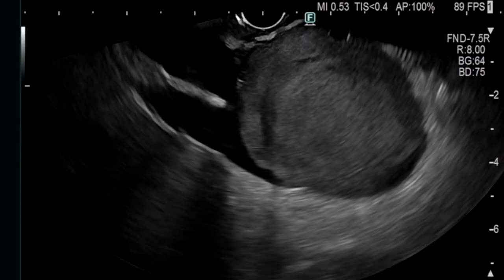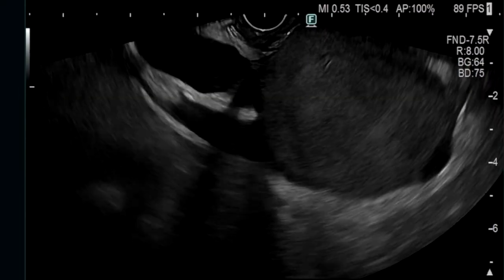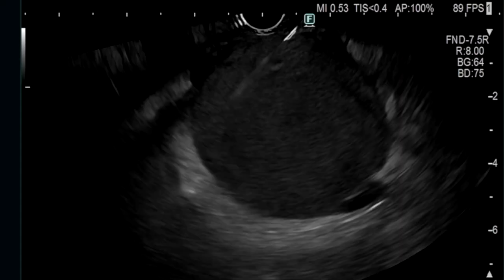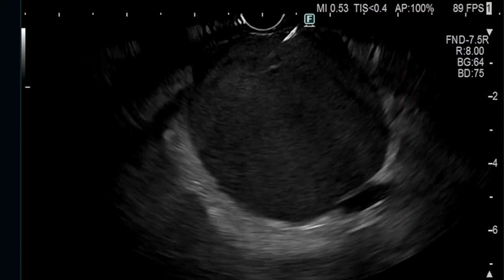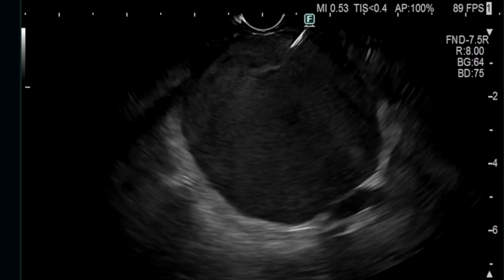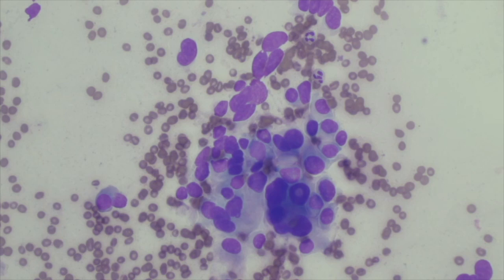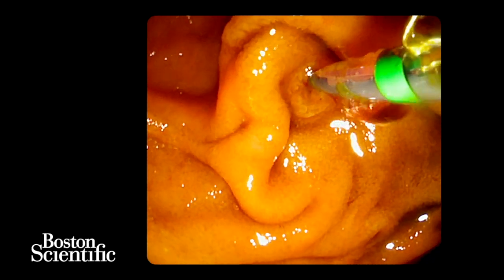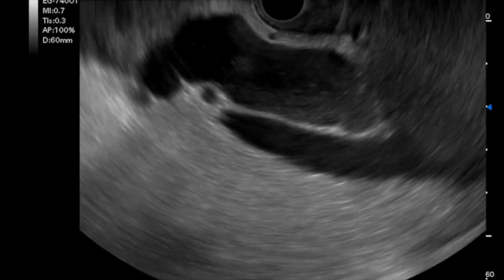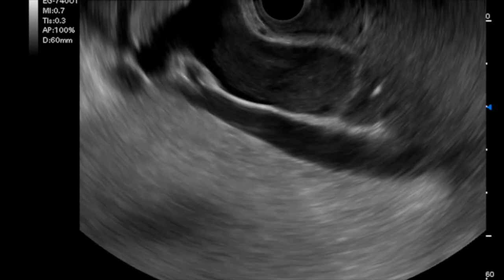A 57-year-old male presented with obstructive jaundice. At EUS, he was found to have a 5cm hypoechoic mass in the pancreatic head causing biliary obstruction. Fine needle biopsy using a 22-gauge FNB needle revealed this to be a neuroendocrine tumour. At ERCP, intraductal access could not be obtained as the mass had caused complete ductal obstruction. Therefore, EUS-guided biliary drainage was attempted using the EG740UT echoendoscope.